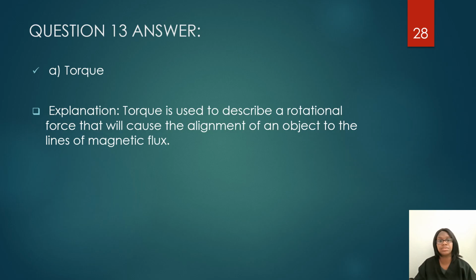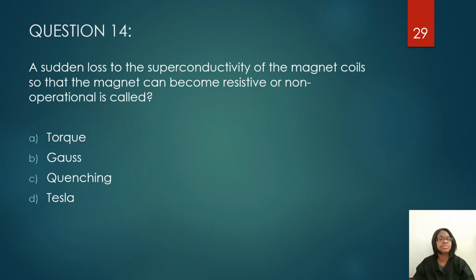So just make sure that you know your MRI safe labels, MRI unsafe labels. If you see any scissors or a stool, make sure it has that label on it before you bring it inside the MRI room. Even a stretcher or a wheelchair, make sure that it's safe to go inside.